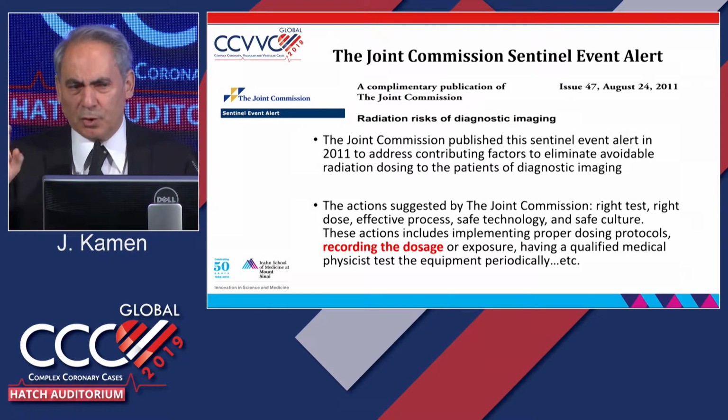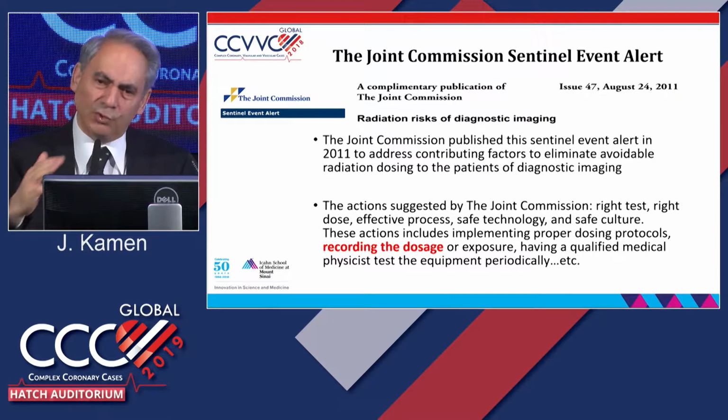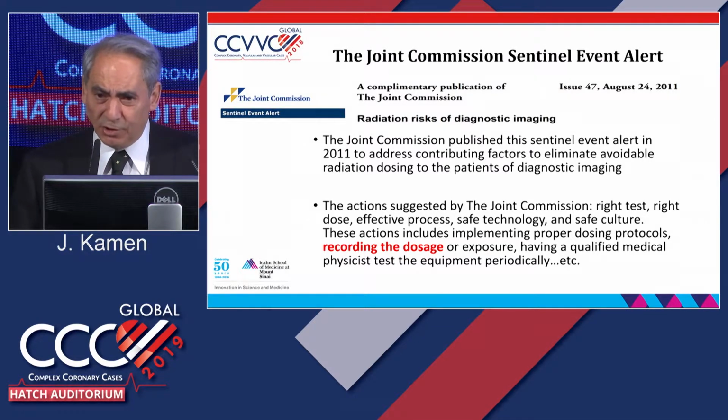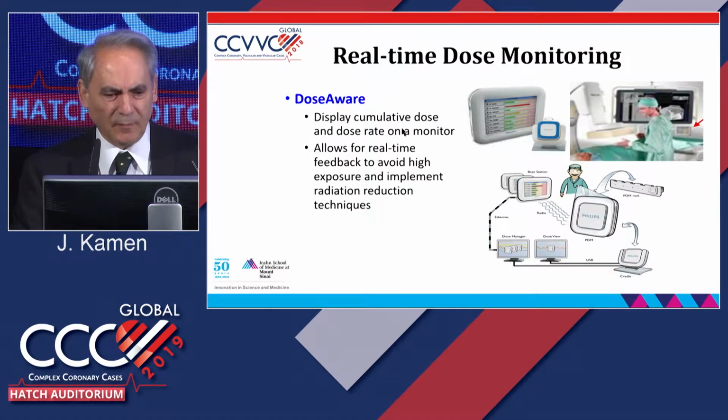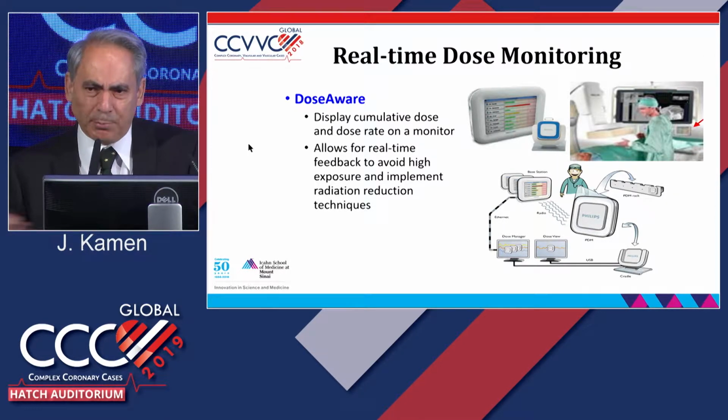99% of fluoroscopy machines do it automatically. That means the data goes to the PACS system. But sometimes your machine is too old, so it might not be able to do it, and you have to write it by hand. At the end of the day, the physician is responsible, so make sure of that. There is something available in the market called a dosimeter, which captures the data if your machine doesn't do it.